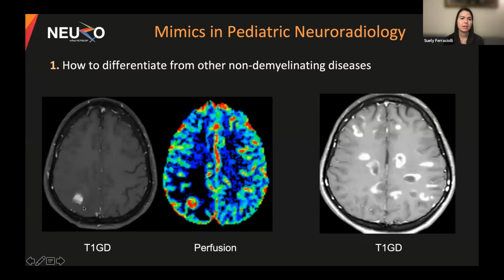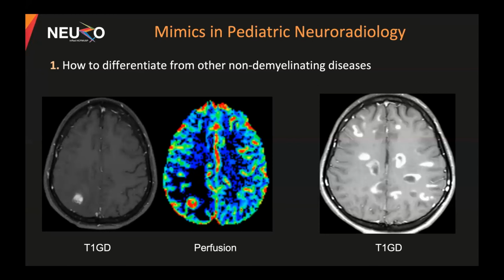So this is glioblastoma. The imaging pattern of enhancement is also different. This one has a nodular, heterogeneous kind of enhancement.